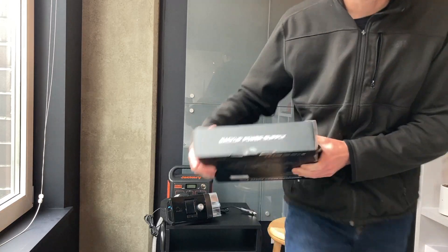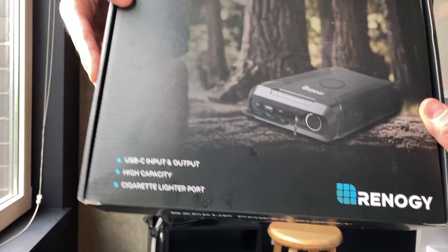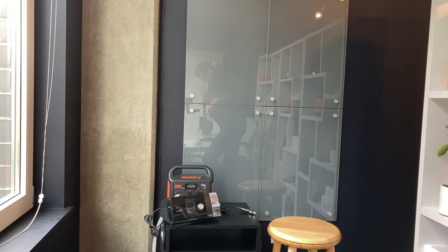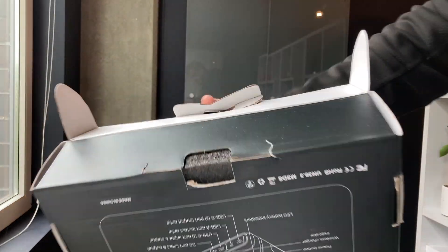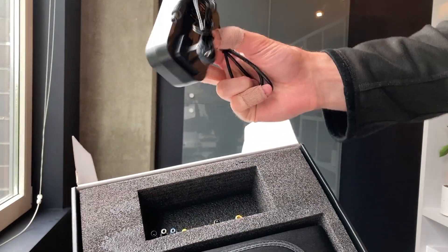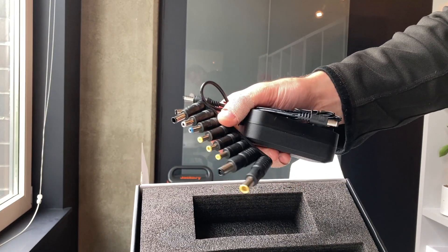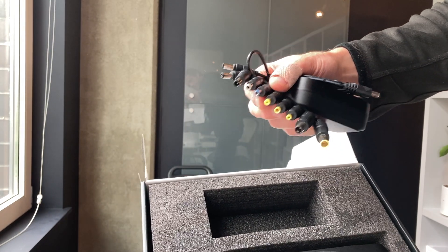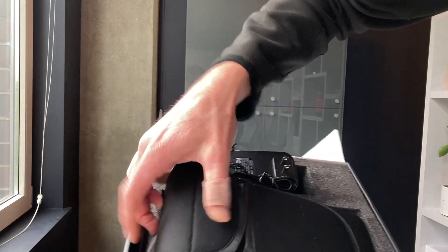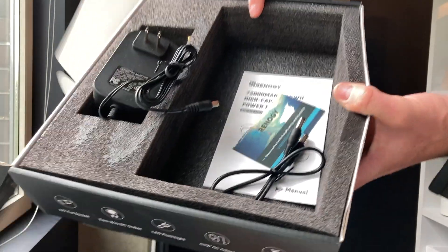Let's go ahead and open this up and take a look. I'm pretty excited to play around with this. It also has a little phone charger at the top, so we'll test that out as well. You can see everything on the back there. Inside the box we have a power AC adapter charger, and look at all those connectors — that's great for plugging into different DC ports. And then there's a little carrying case, more ports in there, and a manual.